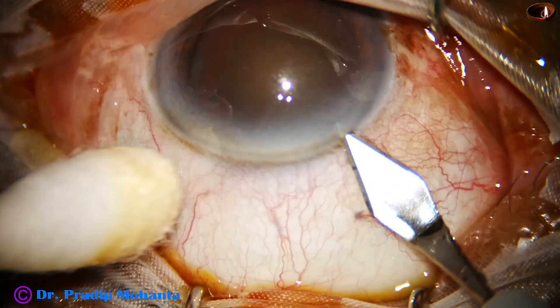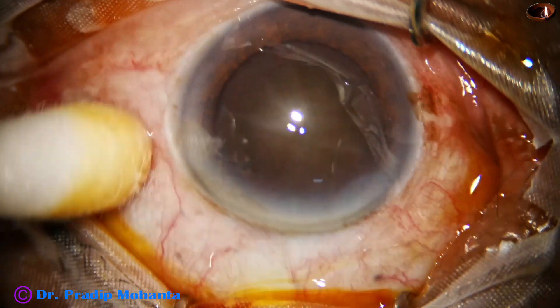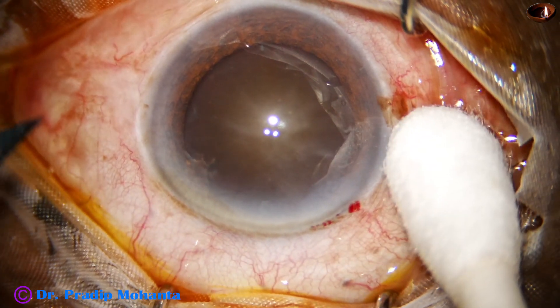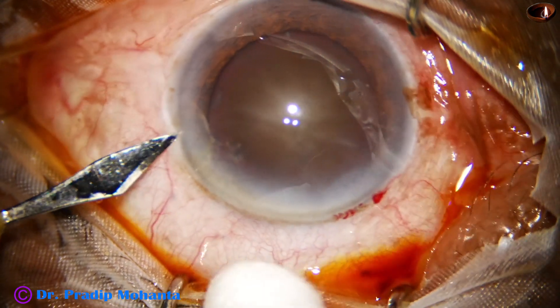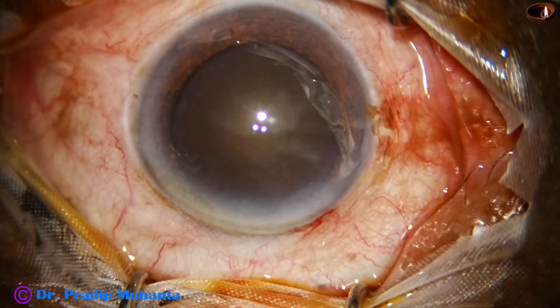This is the main incision with a 2.8 mm steel keratome on the posterior aspect of the limbus. And now, a side port is made on the left side of the main incision. You can do either way — you can make the main incision first or the side port first.